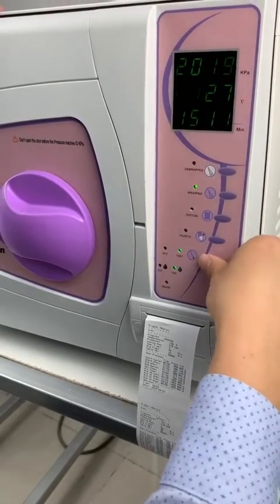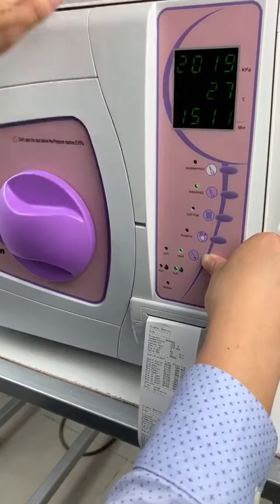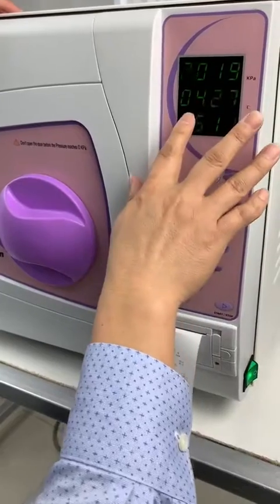So we press the temperature button to move to the time or month setting. For example, the flashing — this is the month.